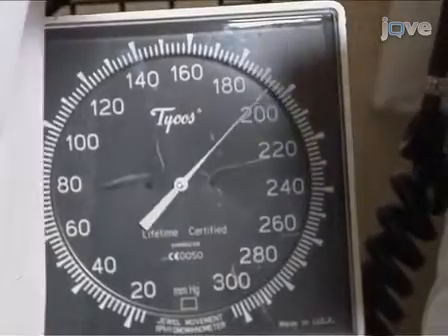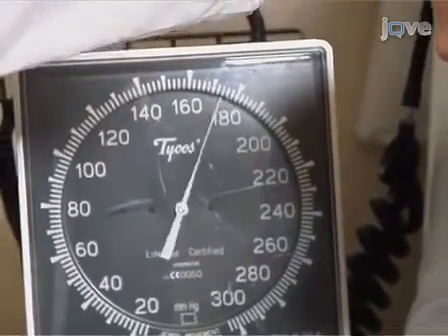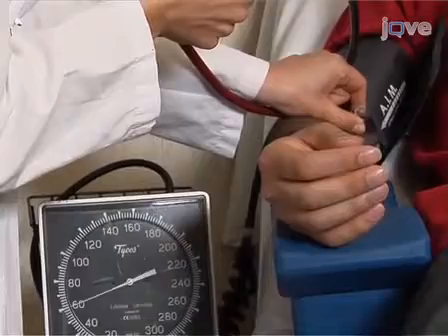Move the cuff to the non-dominant arm, which will be occluded. It is important to know the blood pressure so that the cuff on the other arm can be inflated to a suprasystolic pressure during the arterial occlusion phase of the study.